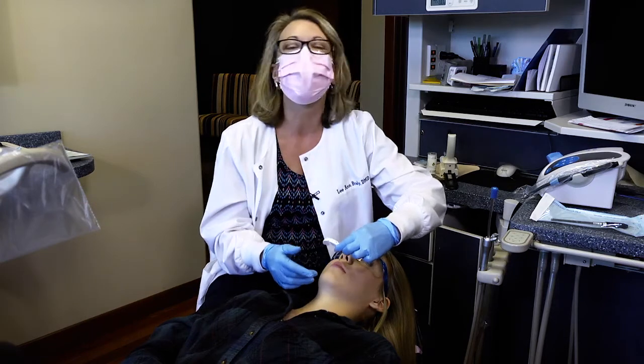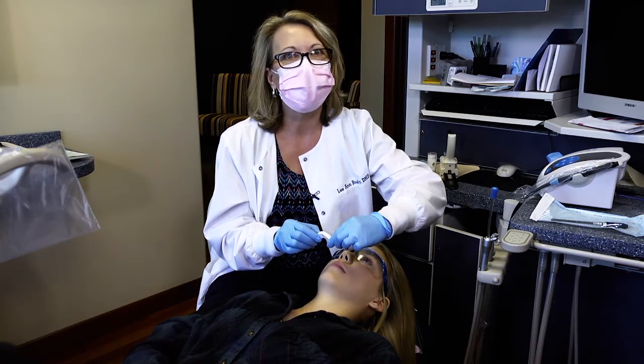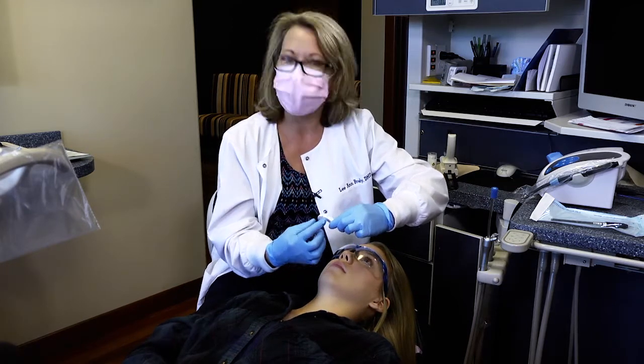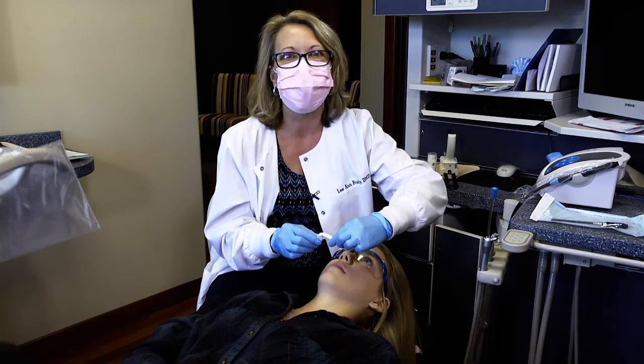I want to make sure this anterior flange of the quick splint is as close to the labial of her upper teeth as I can get it without actually touching her teeth — I need some of the bite registration material on that labial. When I ask Jenna to bite, I'm also seeing how her lower teeth come in contact with the quick splint. I want to make sure back teeth aren't touching and that I'll get even contacts on both sides once the material is set.